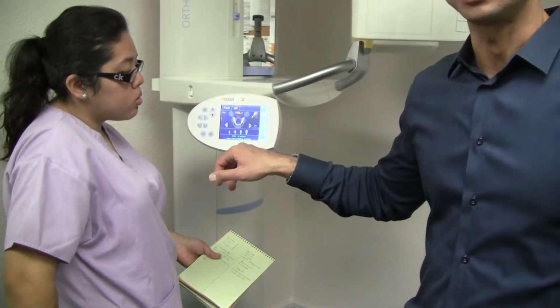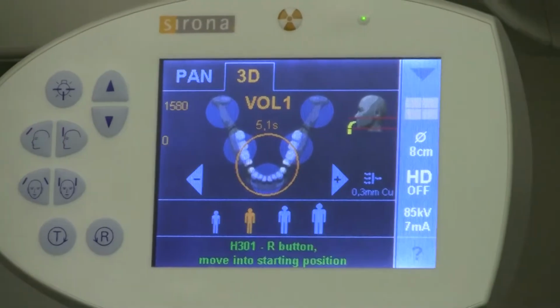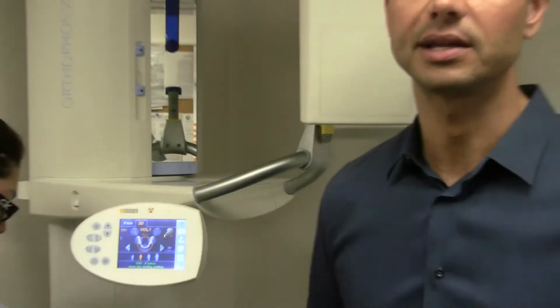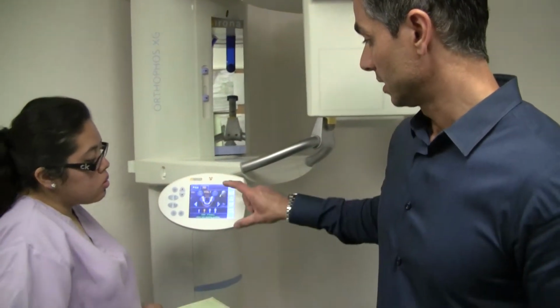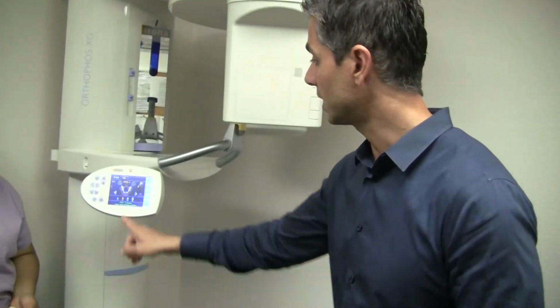This is a very common X-ray to be taken. Okay. So unless you need to, even if you want to look at the posterior, you'll probably be able to get that in the anterior X-ray every single time. The difference is the patient size changes, the anatomy is different from one patient to another. So in case you can't get it all in one, just go ahead and play it safe. If you think there's an issue in the left that you want to take a look at, just go ahead and take it there. But for your standard procedure, you can take three-dimensional, and the anterior covers everything.